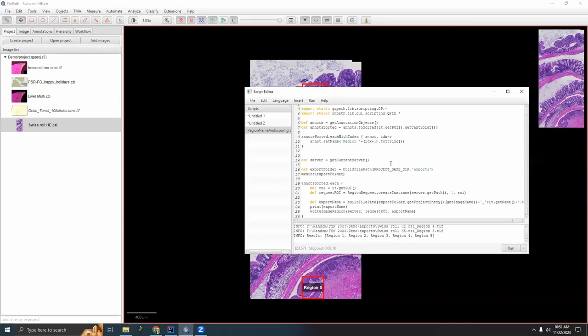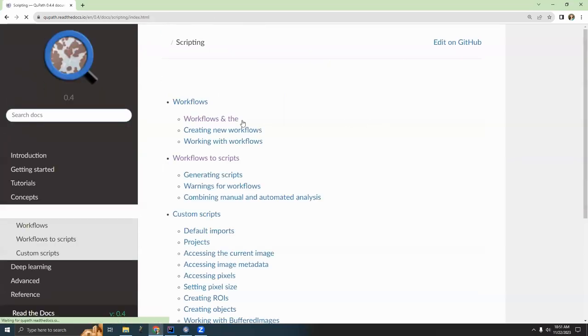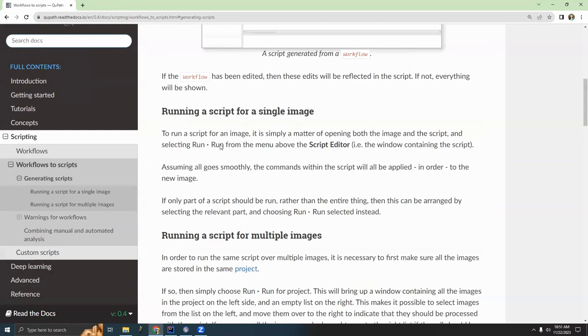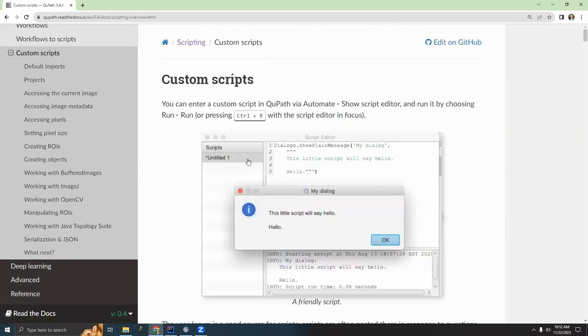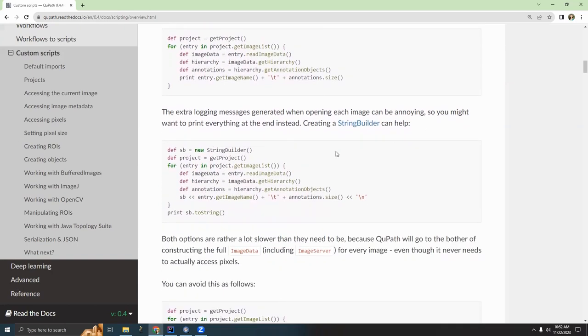I want to point you to just a couple more resources before finishing up. I've mentioned read the docs a few times, but this is definitely where I'd start, especially for people who have never done Groovy scripting before. There's a whole section on scripting that starts with how to go from a workflow to a more edited script, and talks about running for project, and all that. And then it goes into how to make brand new scripts and some helpful tips. There's a lot of resources out there on the internet for Groovy in general. There's a ton of websites that'll help you learn that. But this is all about the very QuPath-specific commands that don't exist anywhere else.